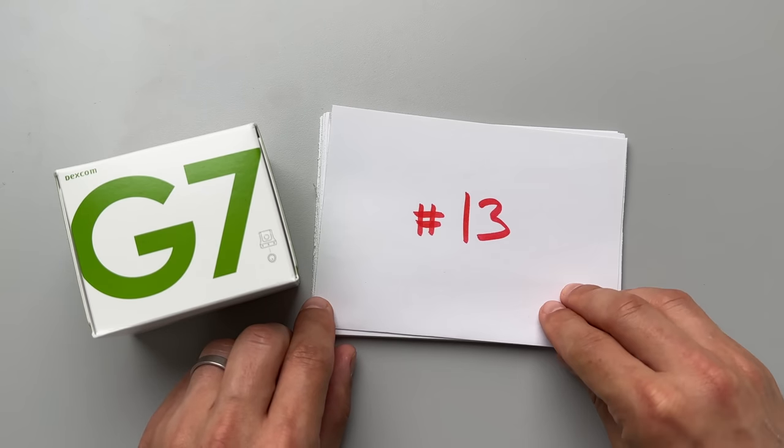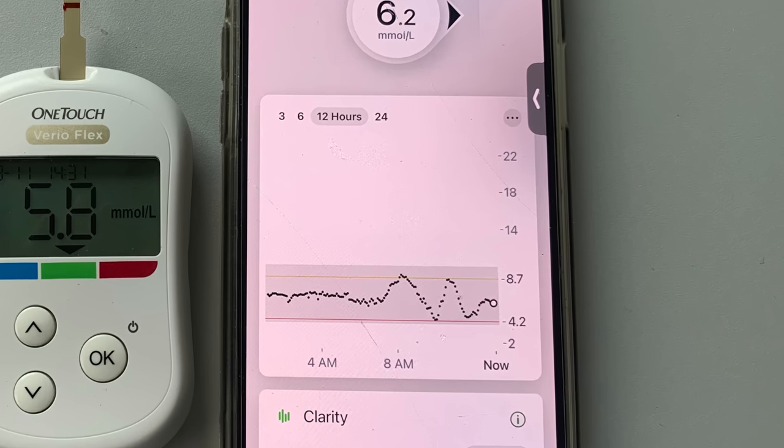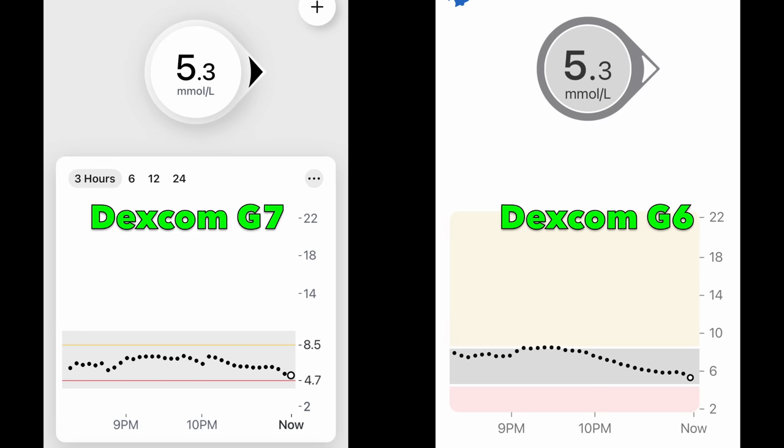Secret number 13: why is the G7 glucose graph so spotty? The individual spots in the G7 graph jump up and down quite quickly, and overall it looks a lot more jittery compared to the G6 graph. When wearing both at the same time, you can see the G6 graph is a lot more stable. The G7 graph was way more stable when I placed the sensor somewhere with more fat, like the back of the upper arm or abdomen. In a more muscular area the readings tend to be more jittery.